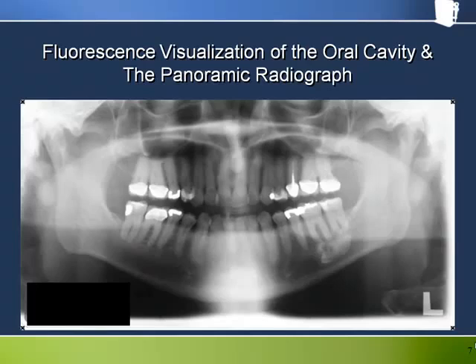This additional radiographic view is beneficial to facilitate investigation of disease that is not readily perceived by the human eye. For example, a vertical bitewing for evaluation of bone loss in periodontal disease, or radiolucence of interproximal regions for dental caries. While radiography provides indirect visual images of human tissue that is displayed either on a computer monitor or on radiographic film, VELscope uses direct, real-time visualization of the tissue.